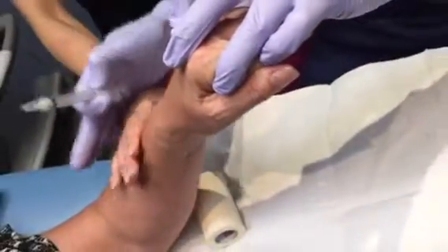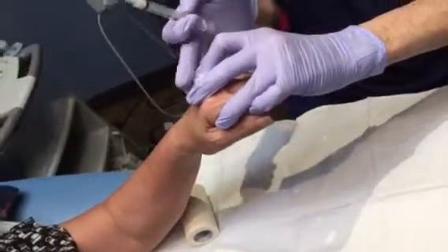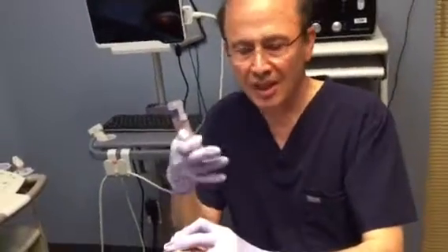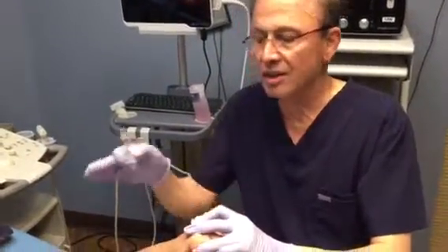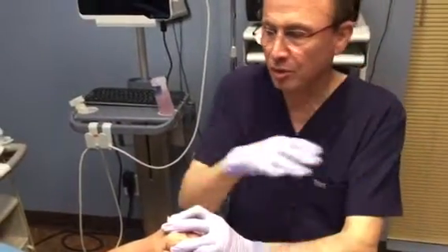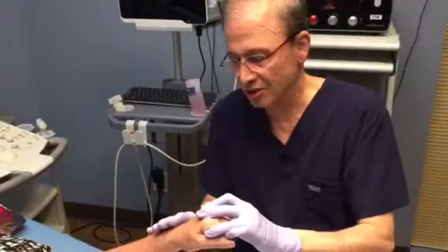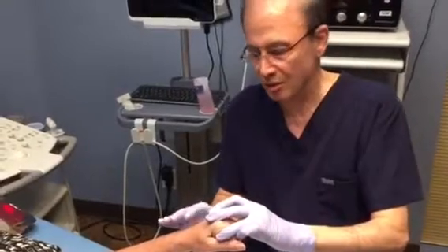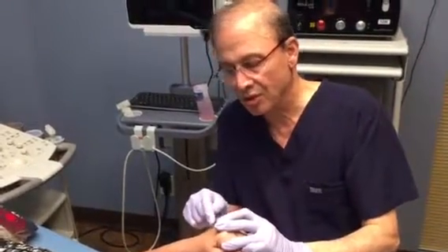We keep pressure here, raise the hand, and then massage distally — from proximal to distal — so that nothing goes off course. Using CO2 helps because the gas dissolves very fast, whereas with air it's a different story: you can have air bubbles for a very long time, even in the cerebral circulation. That's why I prefer to use medical grade CO2.